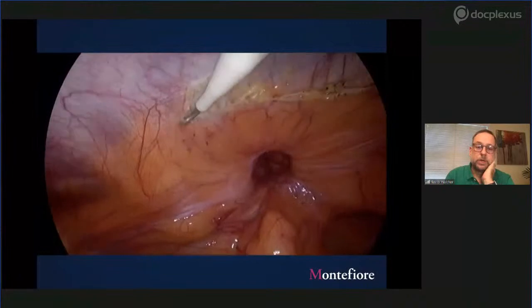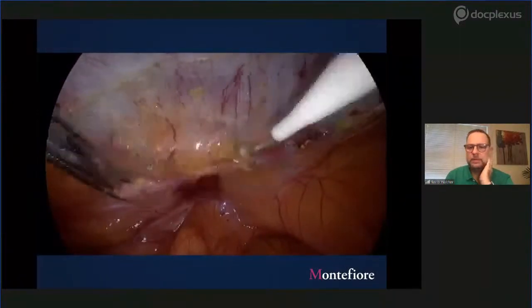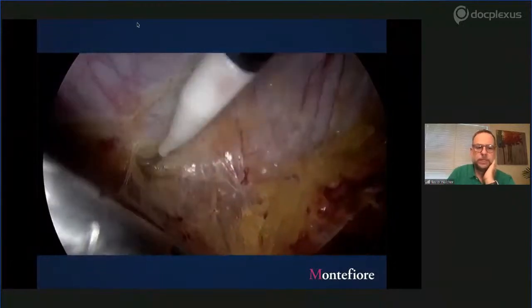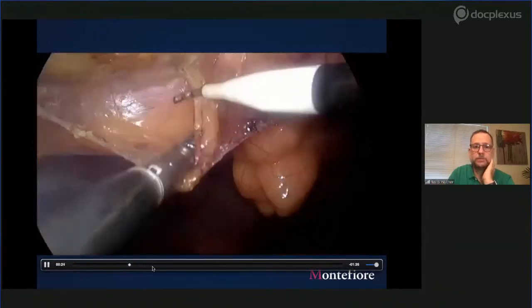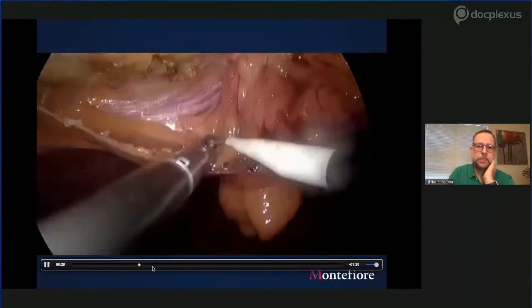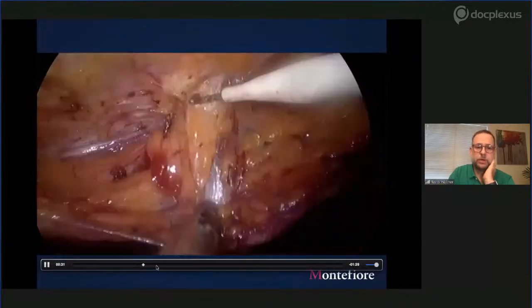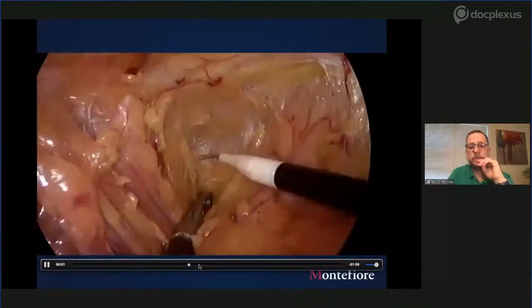So he used a lot of hook as I do in laparoscopy. Just be very, very patient to little by little create your space. You don't have the retraction and articulation of the robotic instruments, but you can do straight sticks. Your ergonomy is just not that good. Reduce the sac, create your big pocket, as mentioned before.